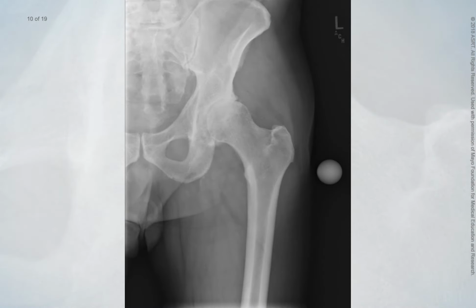The following quality criteria are used to determine if an AP hip radiograph has been produced with proper positioning and technical factors. Collimation and gonadal shielding do not obscure relevant anatomy. Portions of the ilium and pubic bones adjoining the pubic symphysis are visible, along with the hip joint and proximal 1/3 of the femur. The femoral head is visible through the acetabulum.